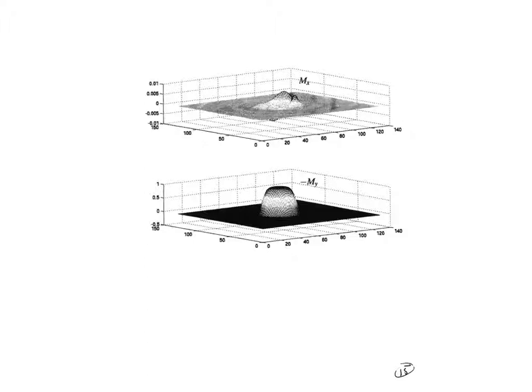Here are the patterns zoomed in. Note the y-axis here. So mx is less than 0.005 and my is about perfect.